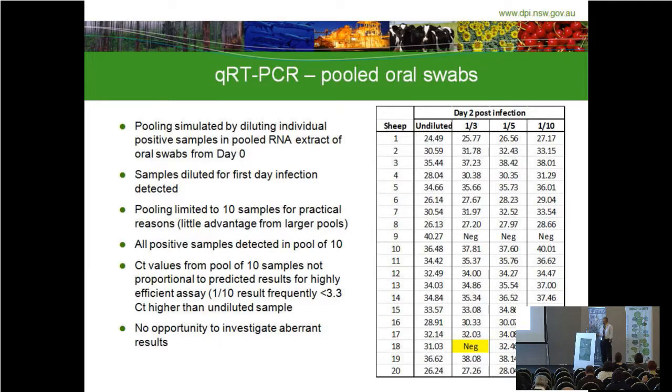We certainly have some serious reservations about this data in terms of the age of the samples and the way that the heat processing was undertaken. If we had fresh samples and perhaps a different lysis buffer, the results may even be better than this, but that doesn't really matter.